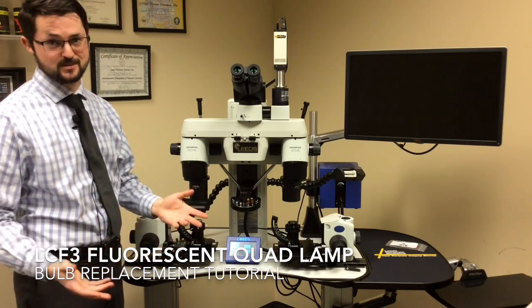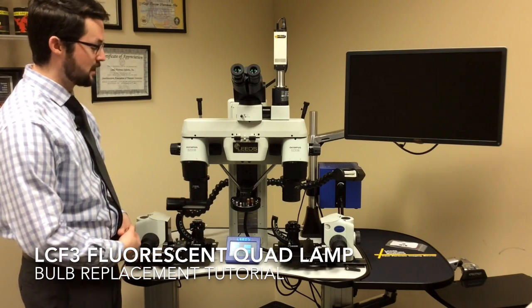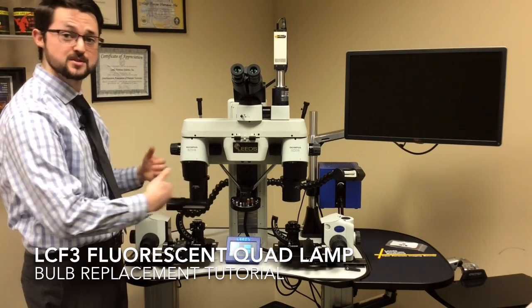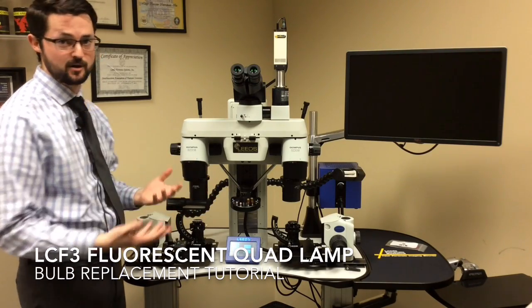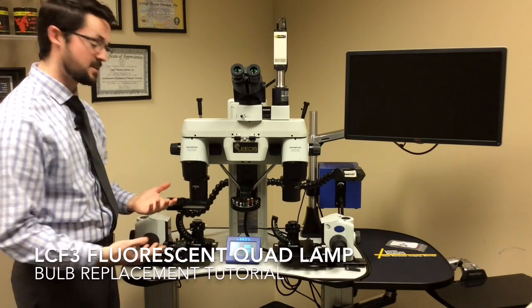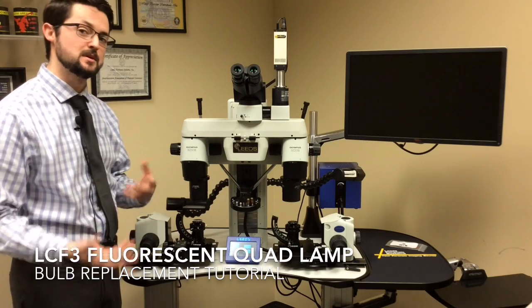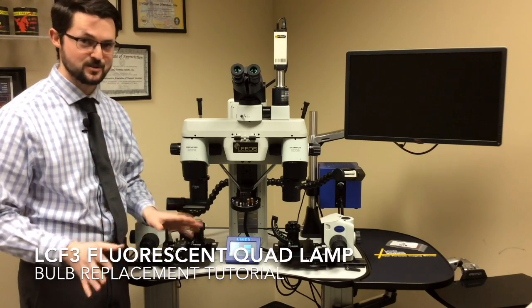Because it's a bulb, sometimes they'll burn out. The quad lamp is designed so when one bulb burns out, actually both sides of the microscope — both bulbs — go dark. So I'm going to say 90% of the time if your quad lamp is not turning on, it's because there needs to be a bulb replacement. Your quad lamp is actually perfectly fine.